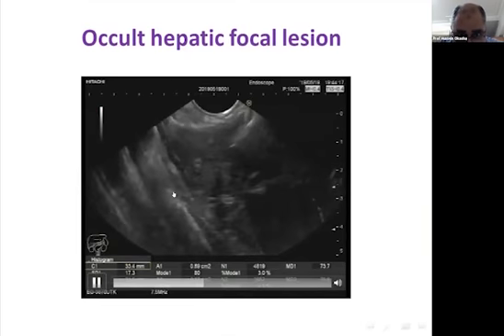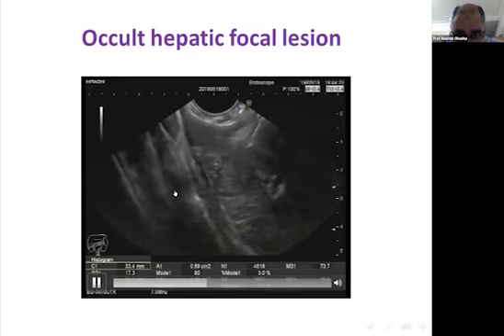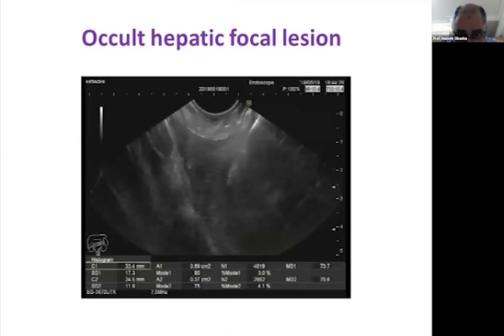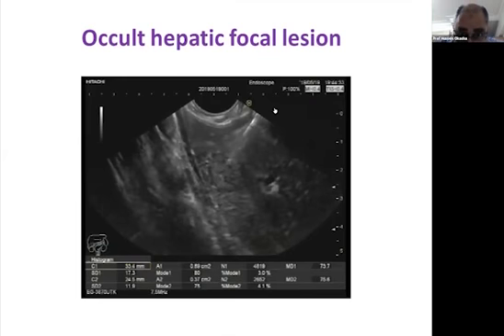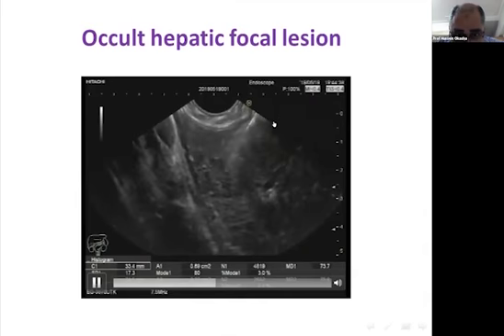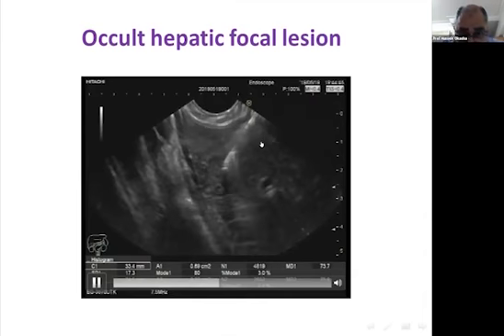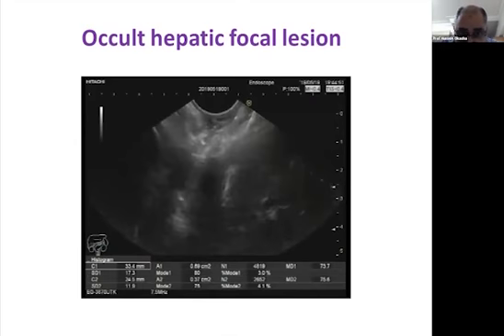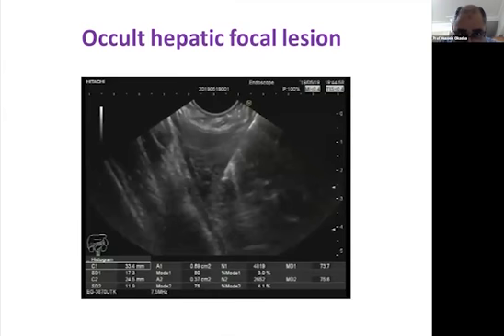examination, and we can do it very simply and very safely by FNA or FNB, but I think FNA is enough in a malignant lesion. FNB is mandatory in normal liver tissue and chronic pancreatitis and so on, but FNA here is enough to diagnose that this small lesion, missed by CT or MRI, is finally a malignant lesion, liver metastasis. And of course, the management of this patient differed completely, from an operable or resectable pancreatic head mass to inoperable and palliative chemotherapy.